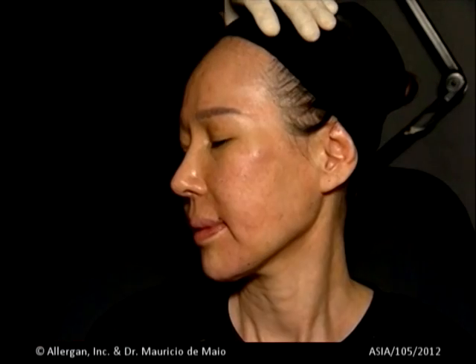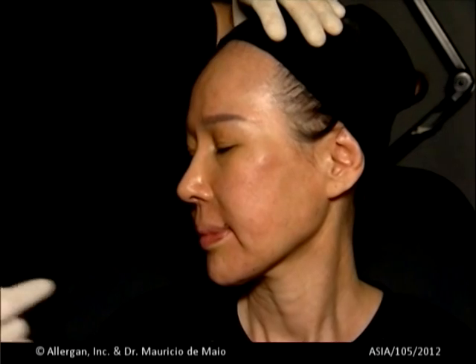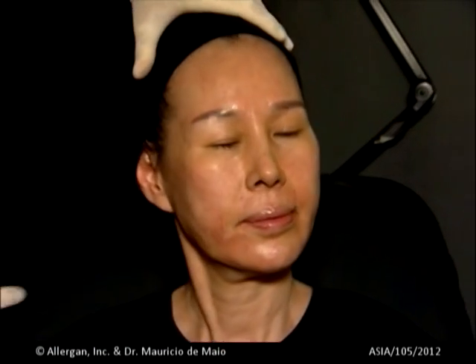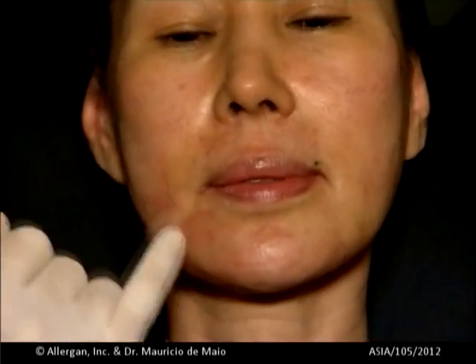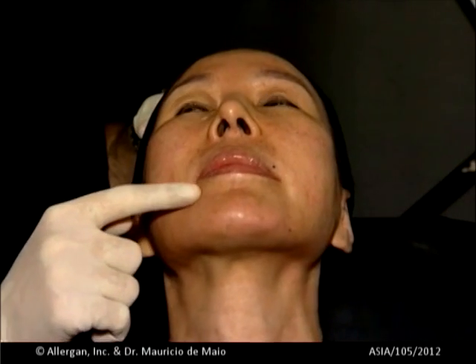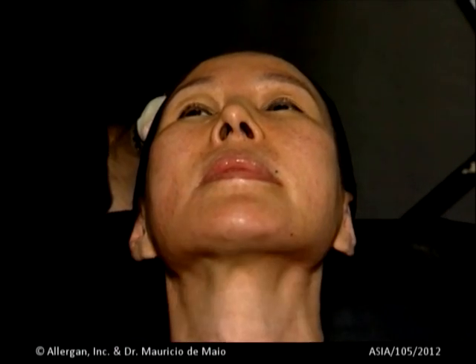Massage, remove the markings, and evaluate the difference between the left side that was treated and the right side. We see that the oral commissure has lifted on the right and also more projected when compared to the left one.